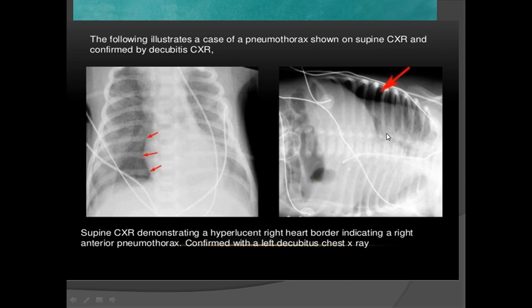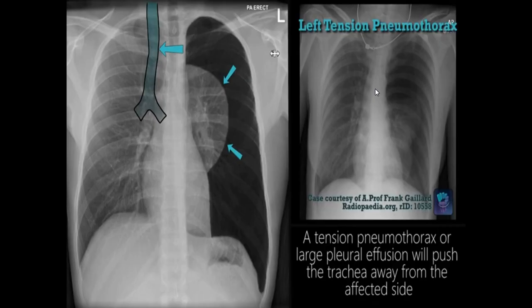To confirm pneumothorax, ask the patient to sit in left lateral decubitus position — the air will rise and become easily visible. In this adult patient example, the collapsed lung and excessive free air demonstrate the deep sulcus sign, with mediastinal shift toward the right, indicating a tension pneumothorax — a major emergency requiring urgent management.